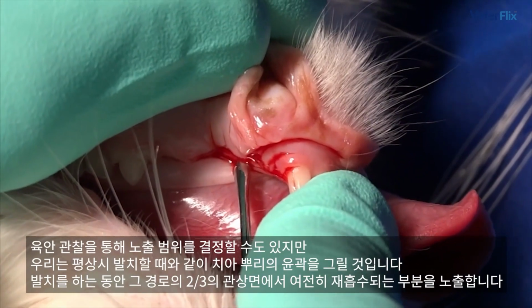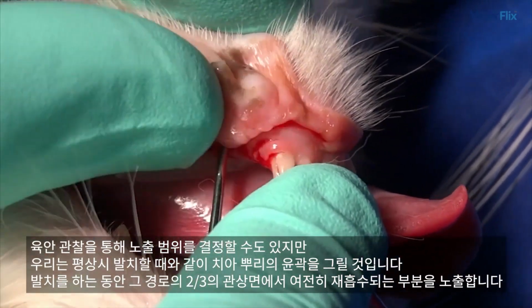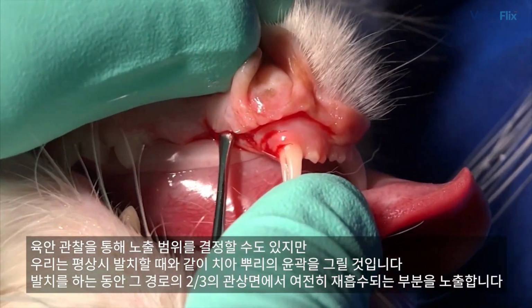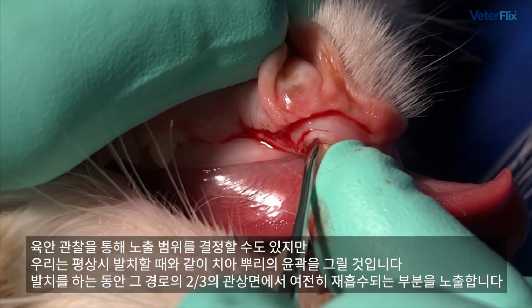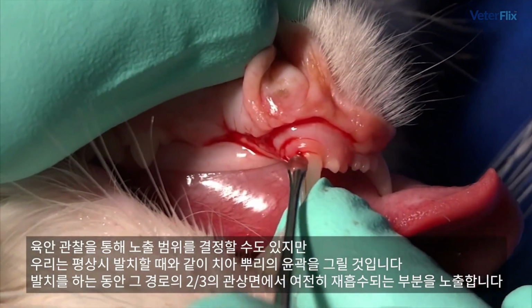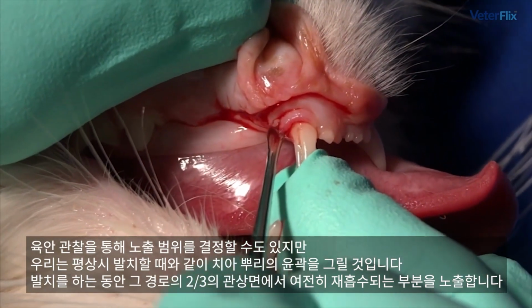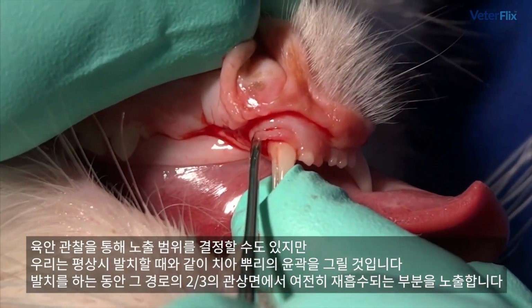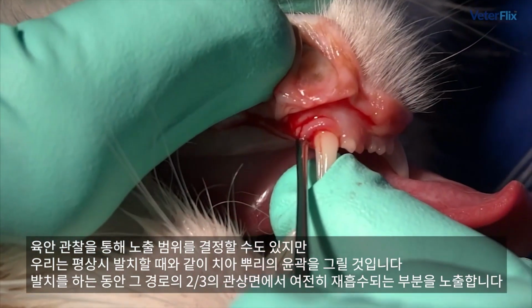Visual observation will give us that determination on how far to go down, but we are actually going to be outlining the tooth root as we would normally during extraction, and extracting the portion that is still resorbing in the coronal 2/3 of that root.